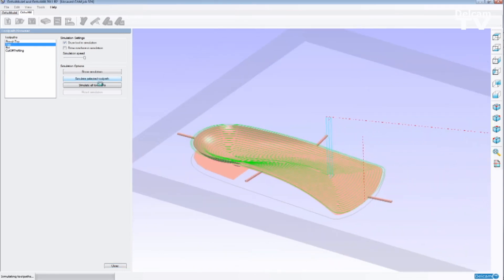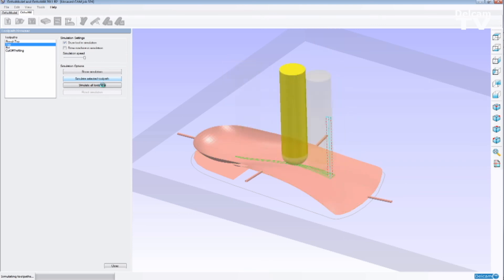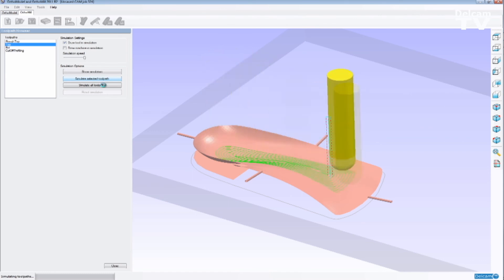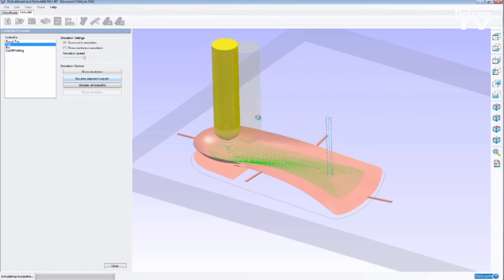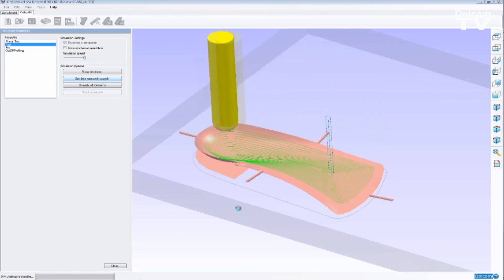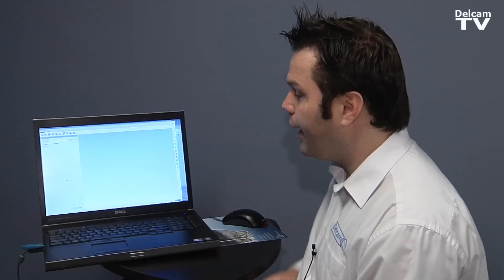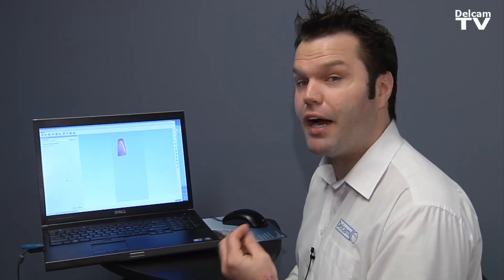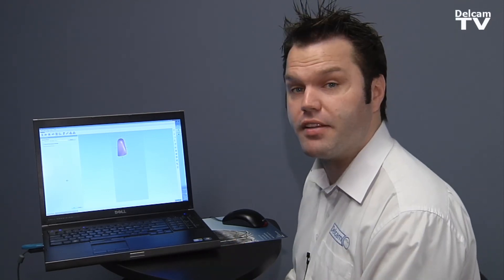Once OrthoMill finishes doing the process, we can also see how the toolpath is going to work on the machine. Once we finish with the machining, we can then create the G-code which is the XYZ positions that the machine is going to follow to cut the orthotic. And OrthoMill can also save the part used workpiece.